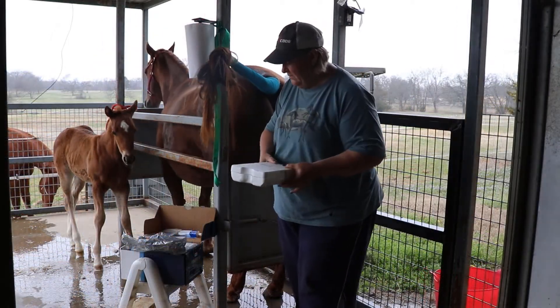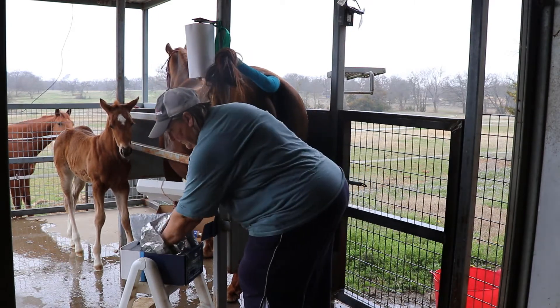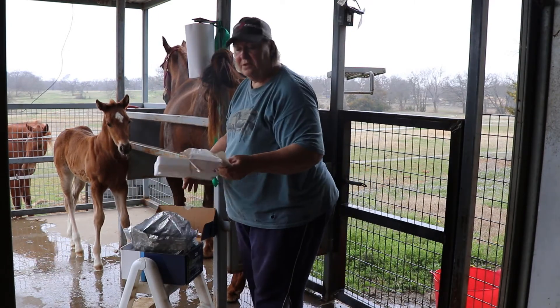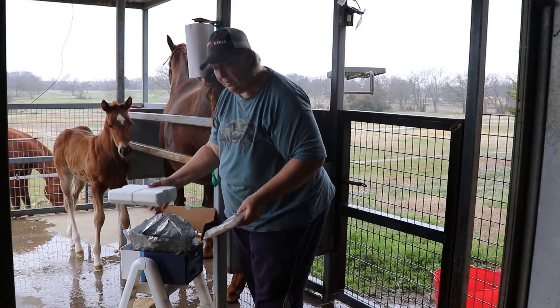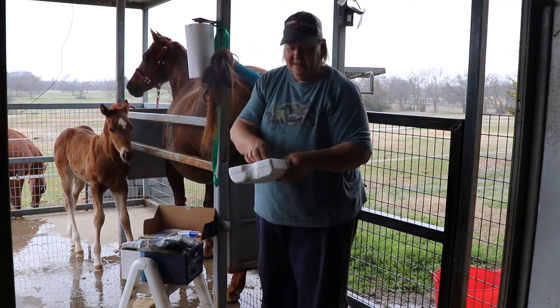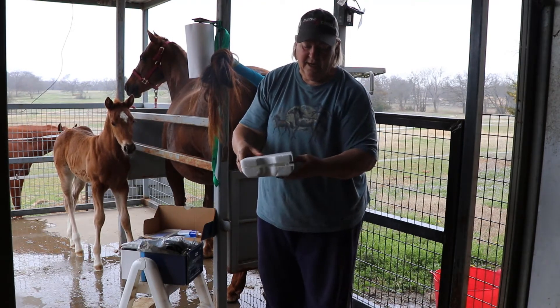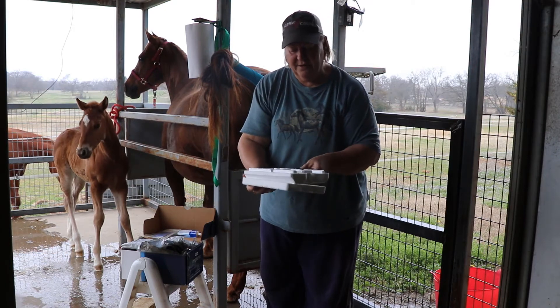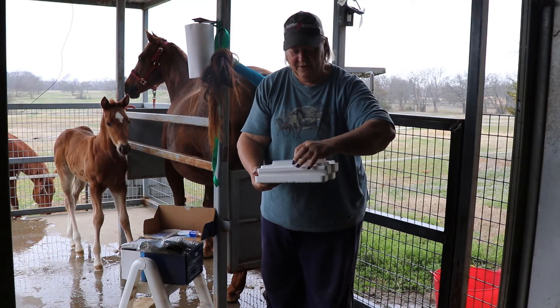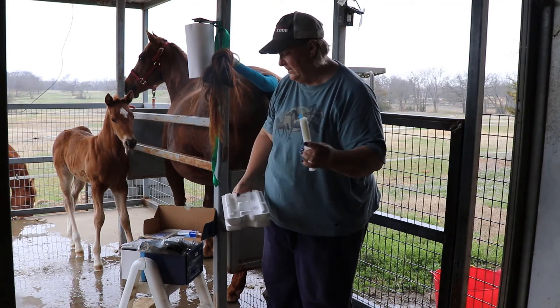Here is the box that the semen came in. It's got frozen packets that keep it chilled to the right temperature to keep the sperm viable for the breeding. This particular stallion collection gave us a nice vial here. There should be about 750 million viable sperm cells within this dose.